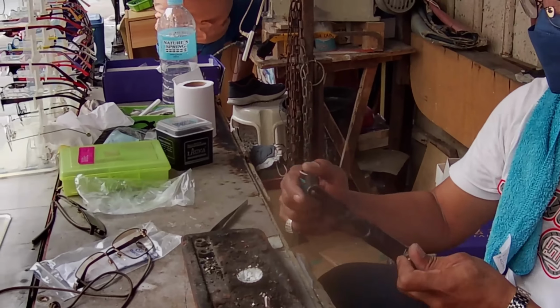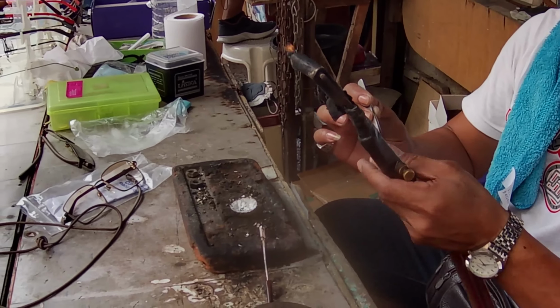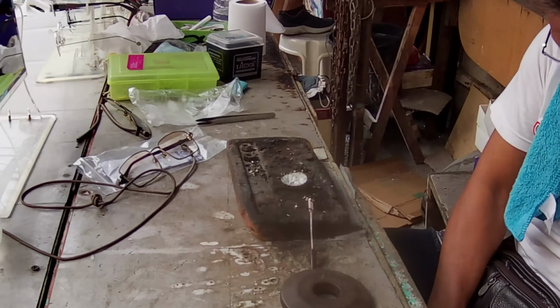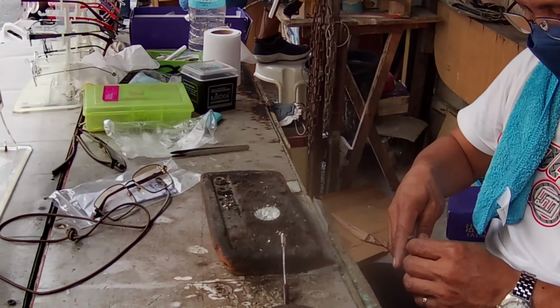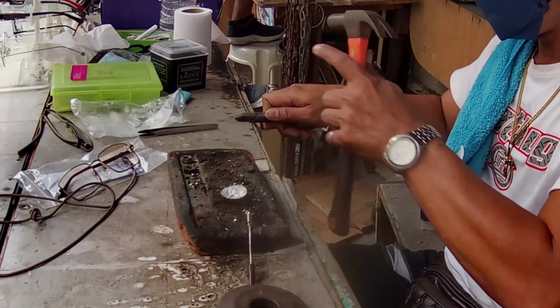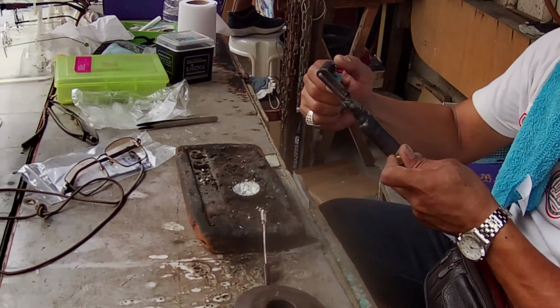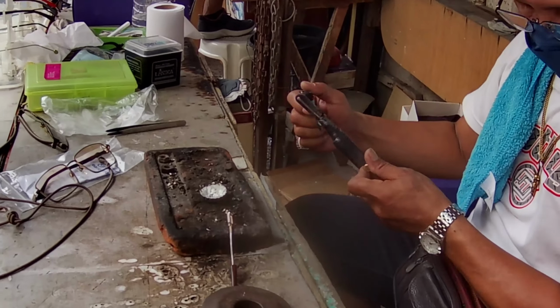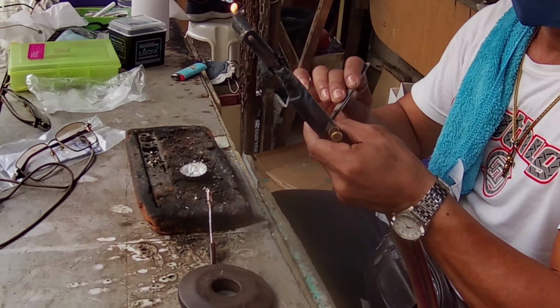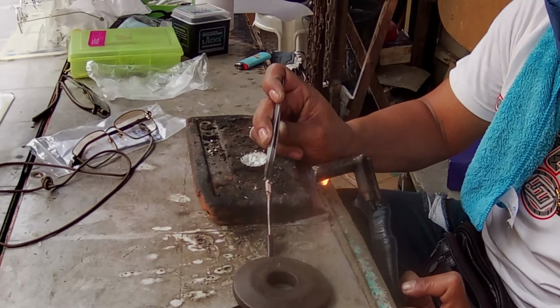So he's now using the acetylene flame. You need to heat, you need to burn the metal that is broken. So you need to join the two broken pieces, the arm and the other piece of the frame, especially the arm. So usually the problem with glasses is always the broken arm. So now he will combine them using the lead.